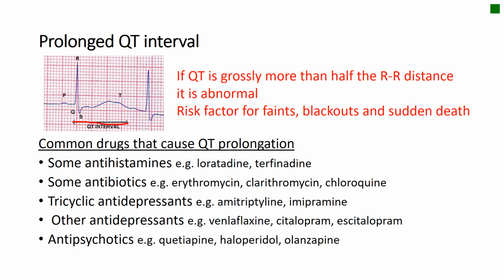It's more than half the RR distance between the two R waves, and so it's prolonged. And this is a risk factor for faints, blackouts, and sudden death.